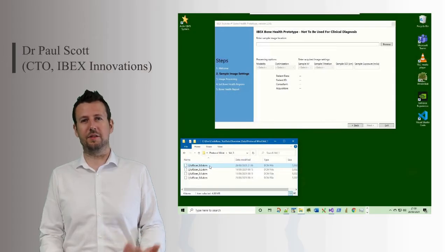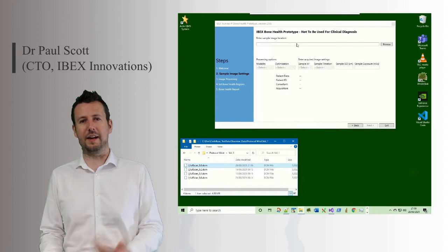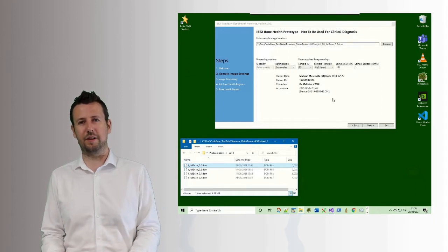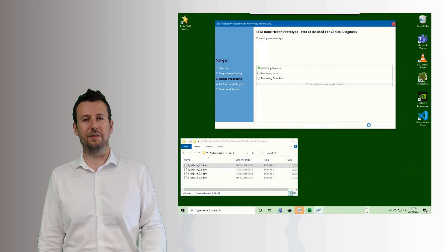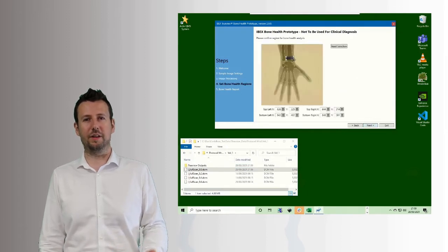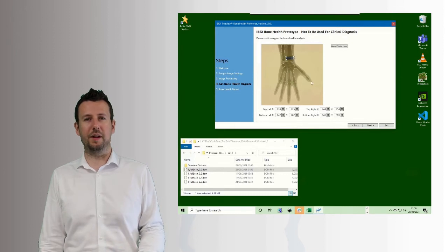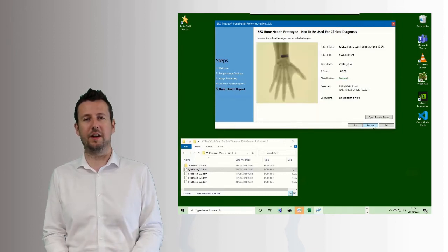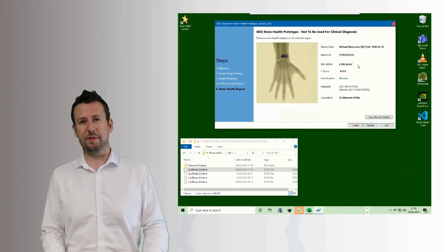As you can see, you just load a standard DICOM image onto the software. It will automatically detect the region of interest — in this case, we're looking at the ultradistal radius region. The software will then perform an analysis of the bone health within that region and provide a report for the clinician, which can be sent out.